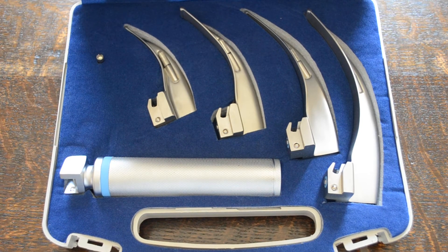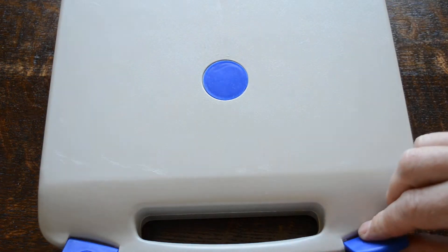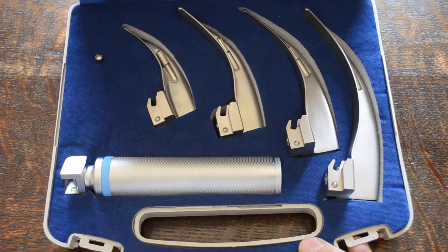Welcome to this video demonstration where we're going to show you the Macintosh Laryngoscope set that is back in stock at Valumed. This is a classic curved Macintosh Laryngoscope set. It comes in the package as shown here — a sturdy hard rigid storage case which they're delivered in.